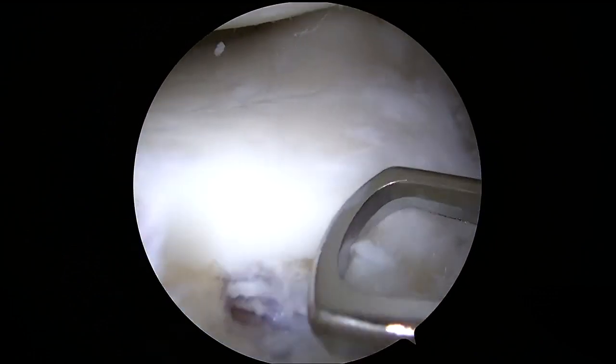Next, a curette and curved shaver are used to decorticate the bone to facilitate better healing of the revision repair.